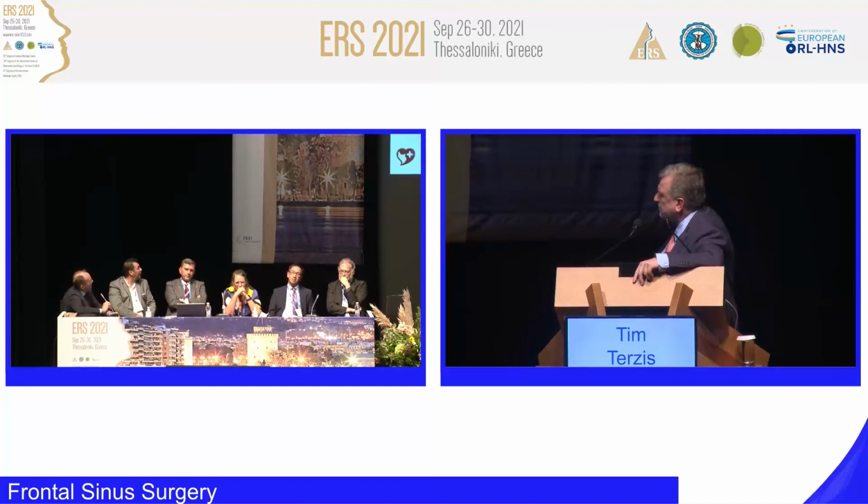And the other side looks not too bad, very wide anterior-posterior diameter, and maybe the problem is not up in the frontal. I'm not sure if there's a tiny lamella very high up in the frontal, but I think the blockage is in the ethmoid cavity. Maybe you go there, maybe it's an incompletely resected concha bullosa, and you open this nicely, and then some secretion will come out. So this could be. Okay. Vlad?